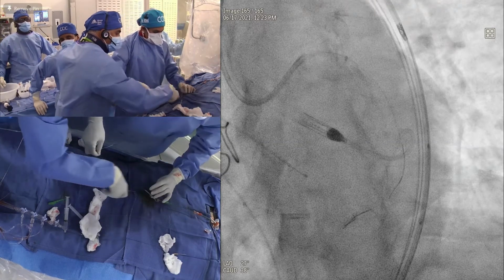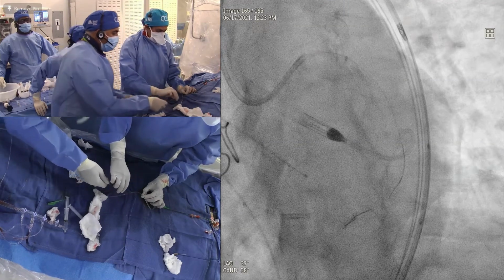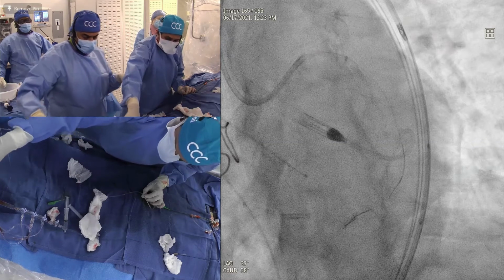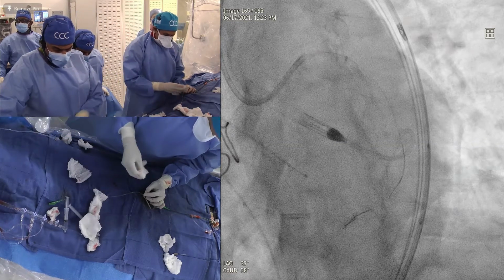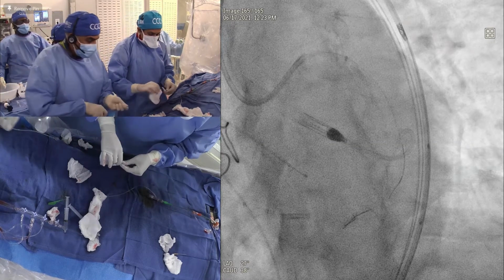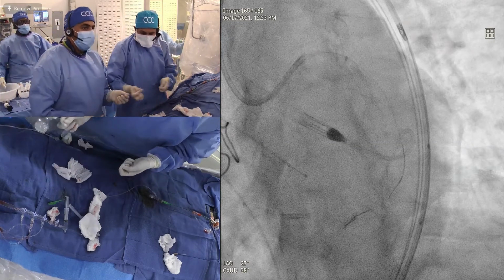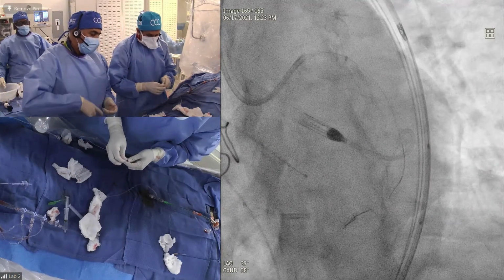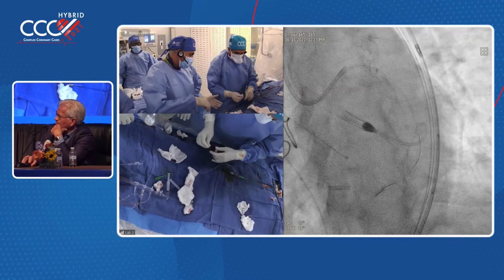I don't think I would have gone up to a bigger burr. I think the artery was so angulated and tortuous that you might have really filleted through it and caused a massive perf. I think they made the right decision to stop with the smaller burr. Sorry, I would have started with a 1.5 to begin, but I don't think I would have upsized after you created that huge dissection.